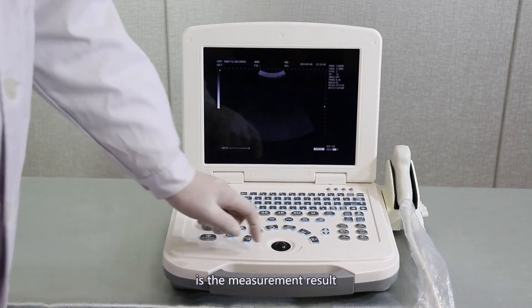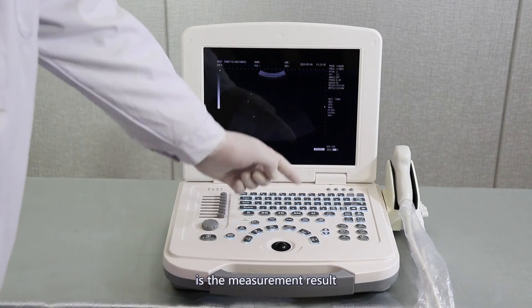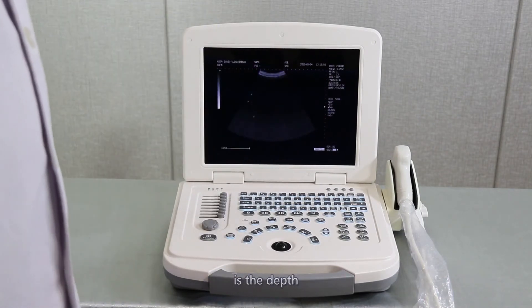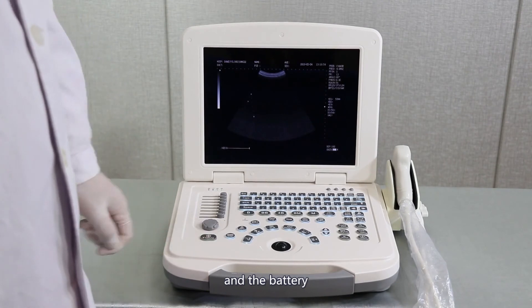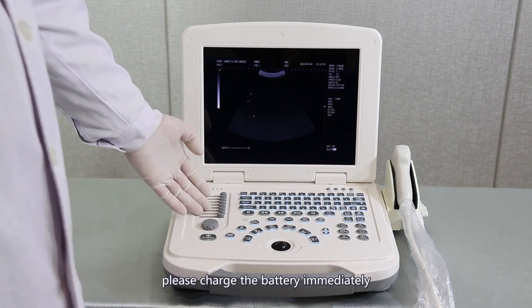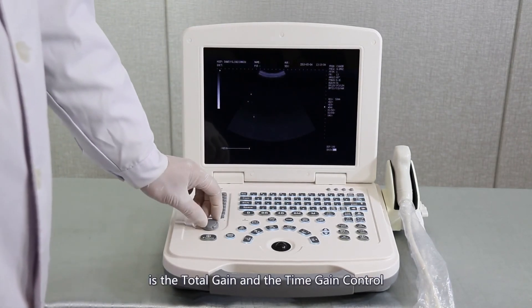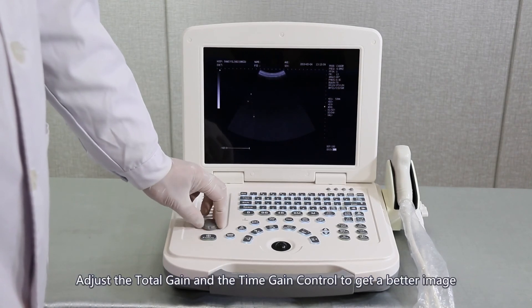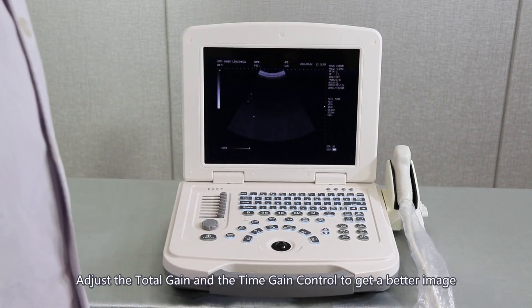On the right is the measurement result. On the lower right is the depth, current workstation, and battery indicator. When the battery is low, please charge the battery immediately. On the left of the panel is the total gain and time gain control. Adjust the total gain and time gain control to get a better image.